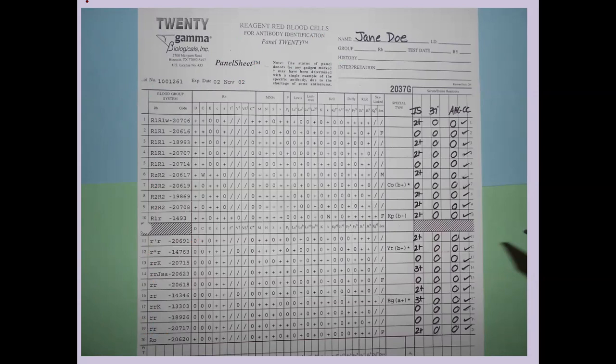And the other thing I'd like to say is, when we look at the pattern of reactivity with this patient, Jane Doe, what do we notice? There are only reactions at immediate spin, and by the time we get to 37 and AHG, those reactions are gone. So this is not a clinically significant antibody. And remember, which class of antibody reacts best at room temperature immediate spin? Hopefully you know, IgM. It would not impact transfusion, but I just set this example up for you guys so you get some practice ruling out, okay?